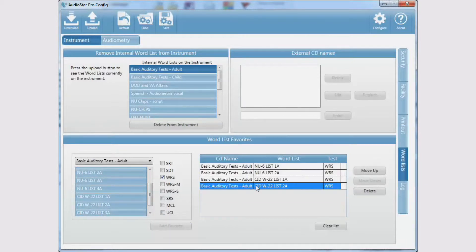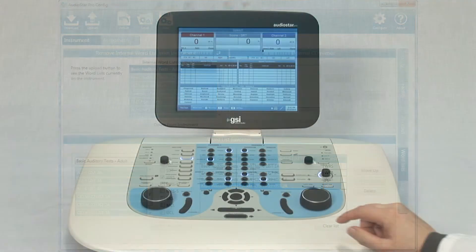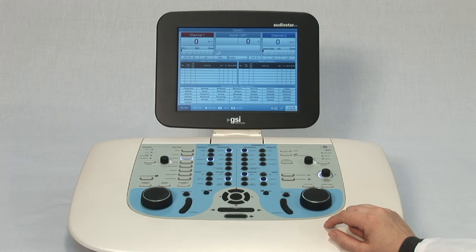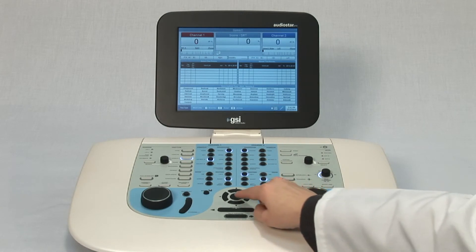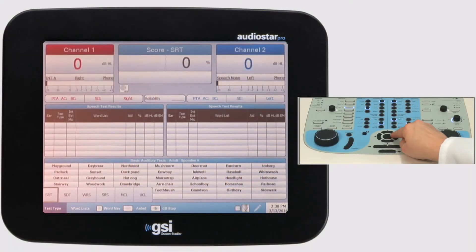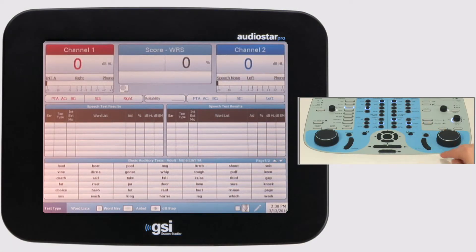When your favorites list is complete, download the configuration to the AudioStar Pro. On the AudioStar Pro, when a speech test is selected, the first word list in your favorites that is associated with that test will load.